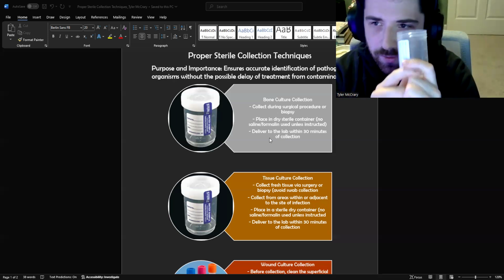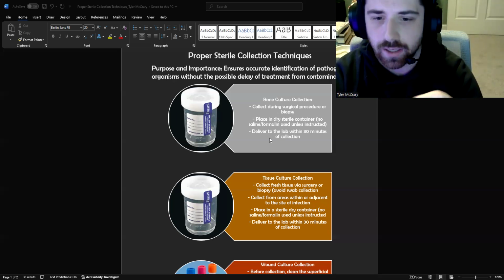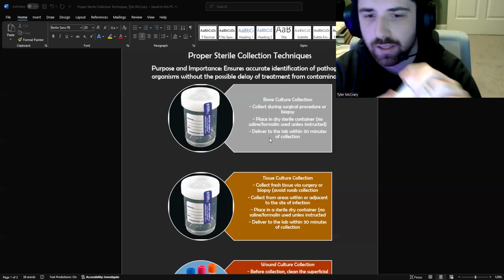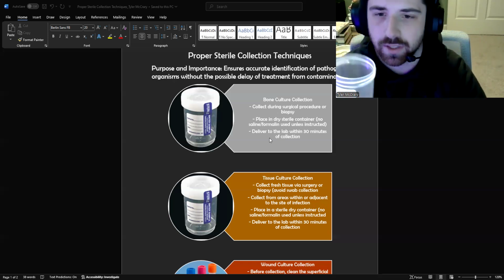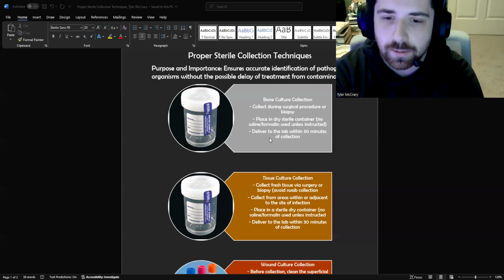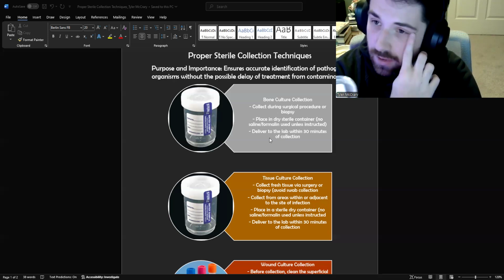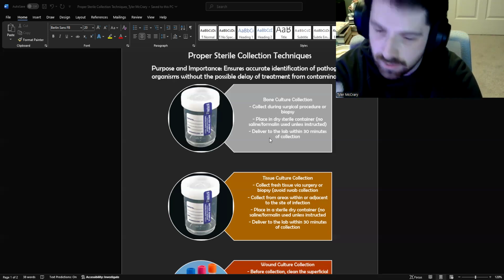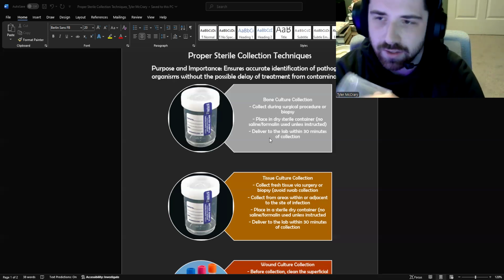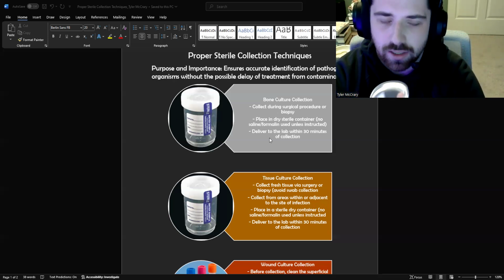This can also be used for tissue cultures as well. For example, we get toes a lot. If during surgery they were to amputate a toe and put it in this container, this would also just be another sterile dry container that could be used. Sometimes they may want it in a diluent, but we don't request that unless we specifically instruct them to.